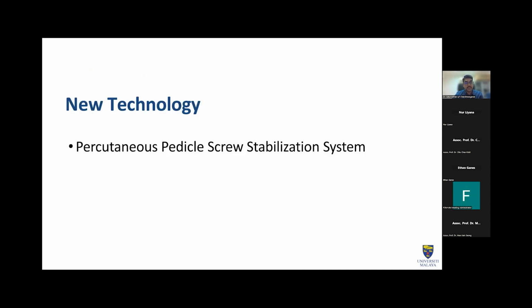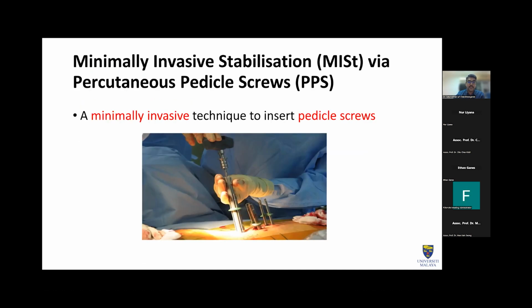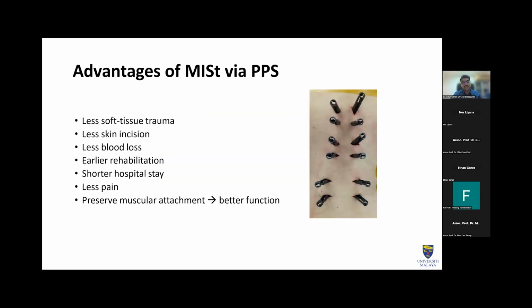So there's a new technology, the percutaneous pedicle screw stabilization system, a minimally invasive technique to insert the pedicle screws. The advantages of this technique are less soft tissue trauma, less skin incision, less blood loss, early rehabilitation, shorter hospital stay, less pain, and it preserves the muscular attachment for better function.